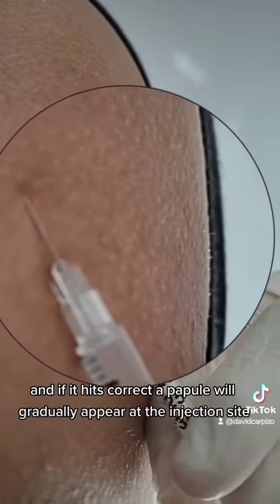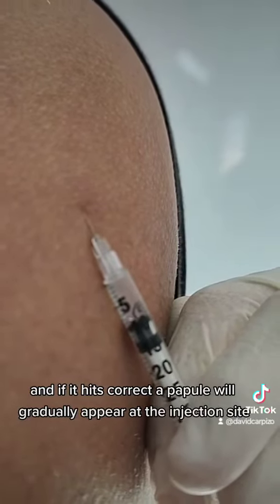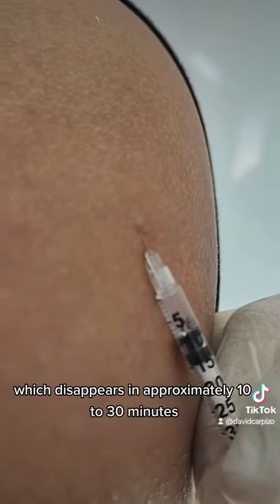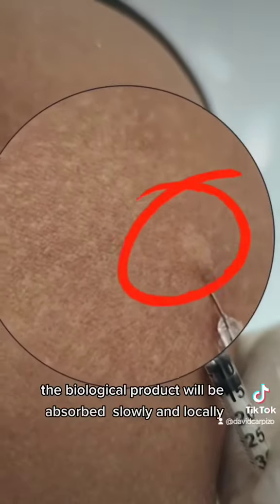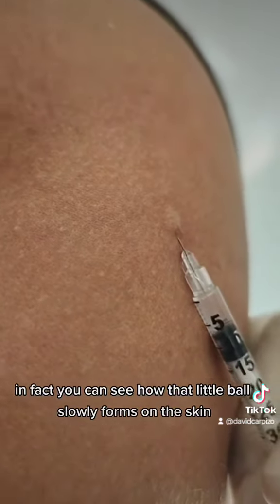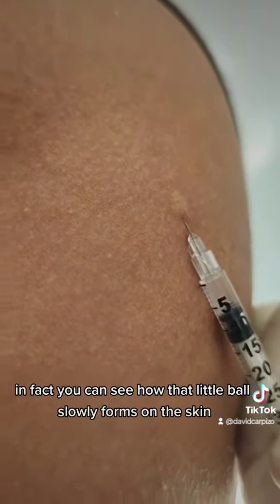If the technique is correct, a wheal or papule will gradually appear at the injection site, which disappears in approximately 10 to 30 minutes — this is totally normal. The biological product will be absorbed slowly and locally. In fact, you can see how that wheal now slowly forms on the skin.